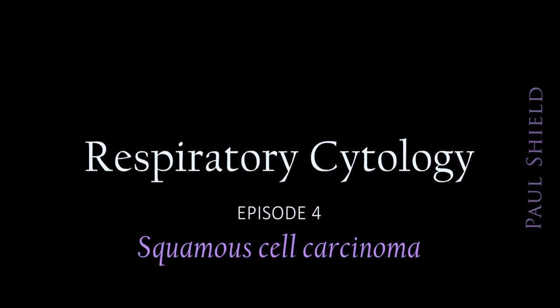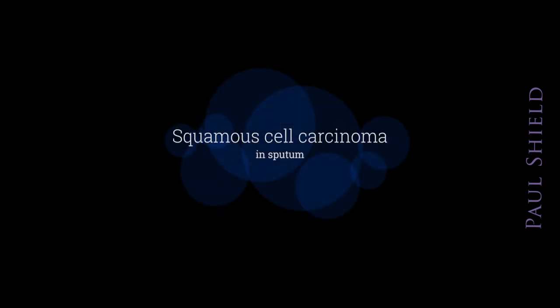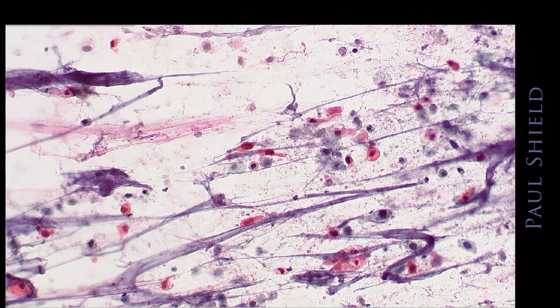Hi, it's Paul. Let's look at SCC in respiratory specimens. This is the second most common malignancy seen.